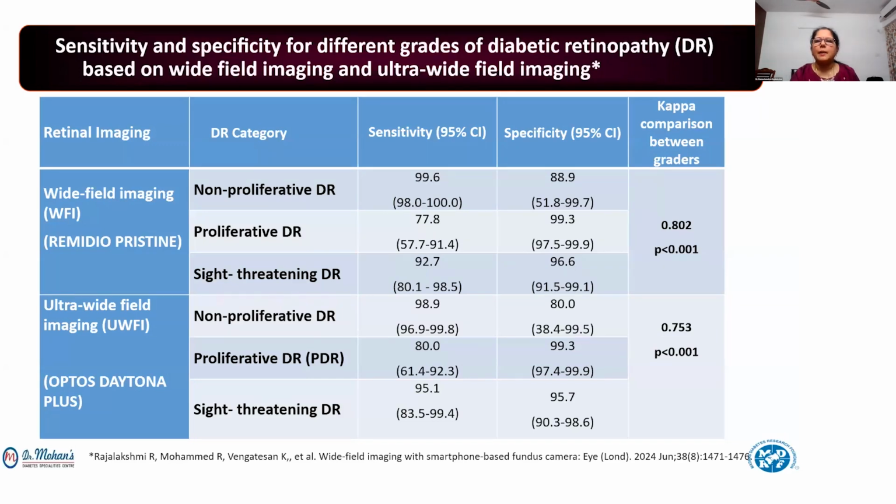And the kappa between the graders was quite high, above 0.8, for the two retina specialist graders who graded the fundus images.